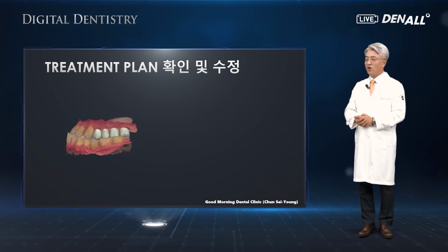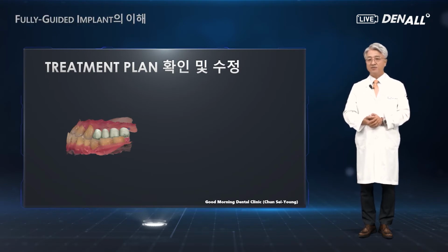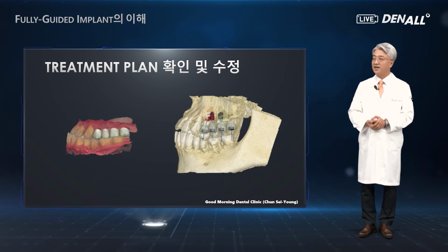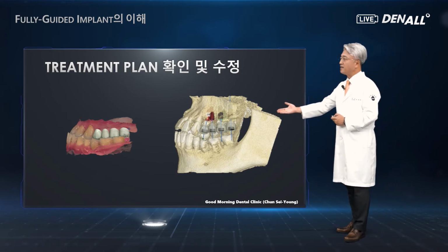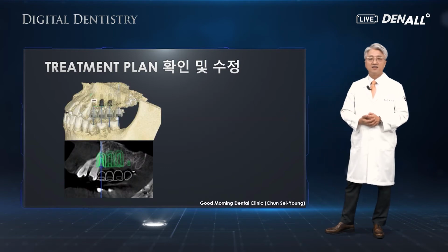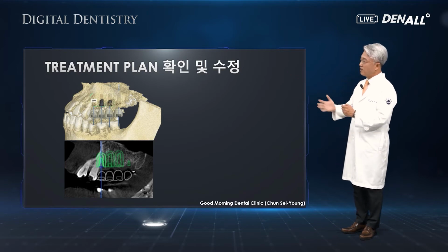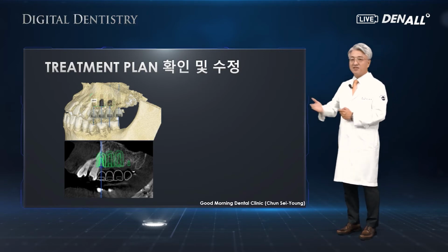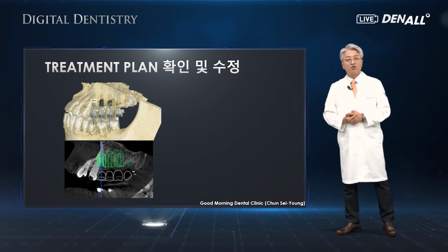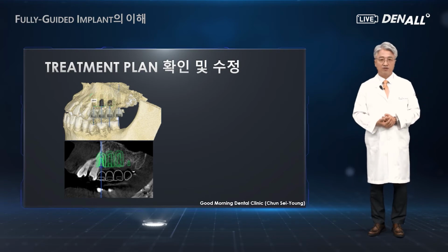During the implant planning, this can be very helpful as well. In this patient, we plan to place 4 implants, and the surgery was planned. And during the simulation, as you can see, the implants are positioned at each tooth place, and there's interference between them. Therefore, they were corrected to be in parallel with each other. Number 24 fixture is interfering with the root of the canine in this simulation.